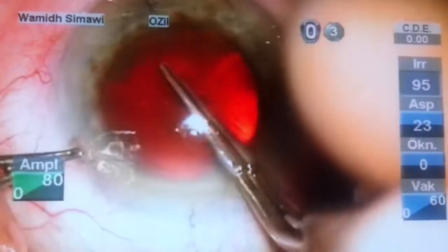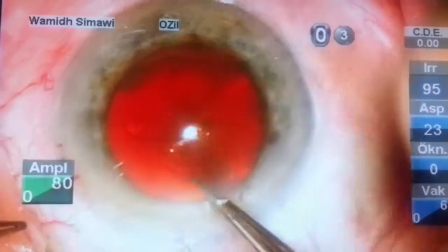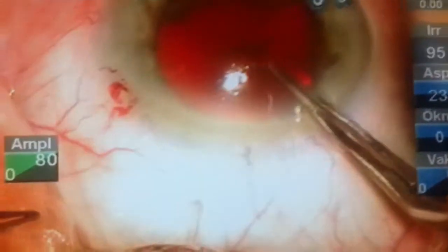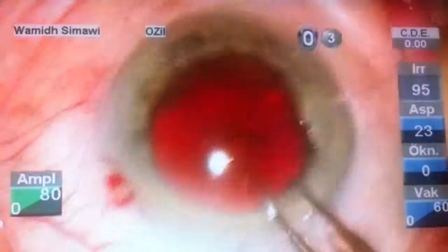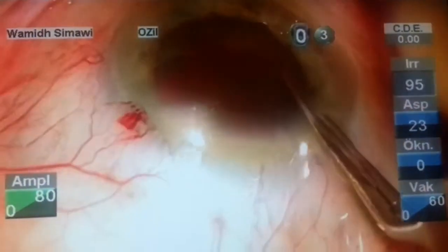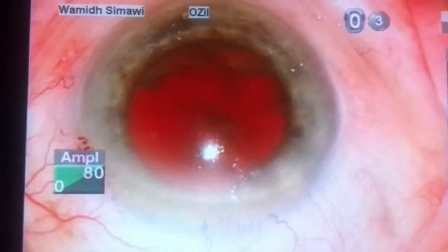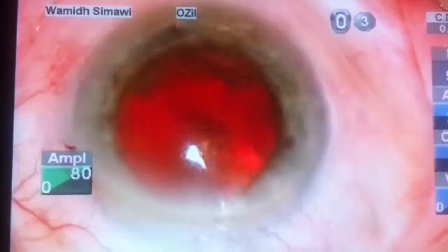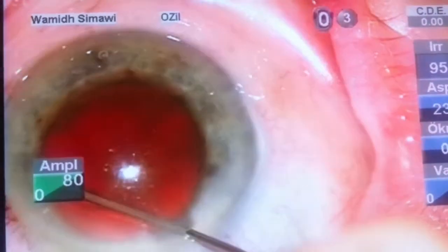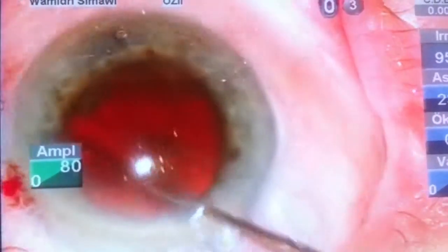After creating two paracenteses, a main incision with 2.2 mm, injection of preservative-free lidocaine and a visco-adaptive device, we create the capsulorrhexis at about 5.0 to 6.0 mm. We always try to avoid a small rhexis diameter in hard nucleus cataract surgery because it will complicate the situation, so try to make it an average or larger diameter.